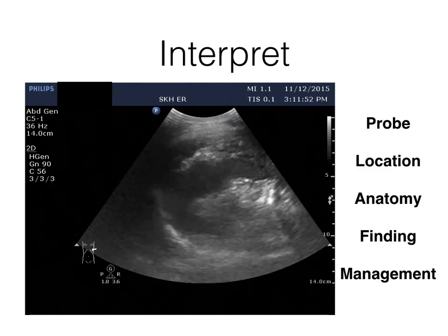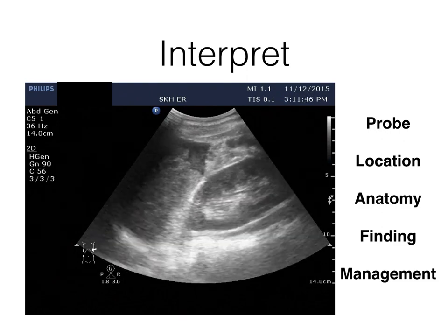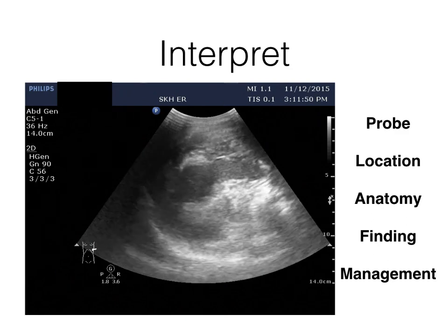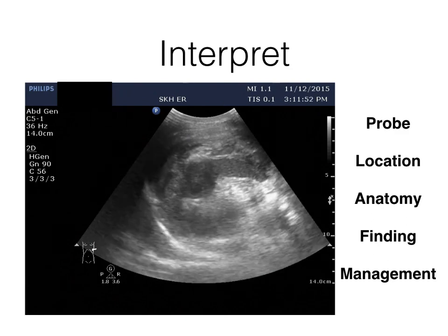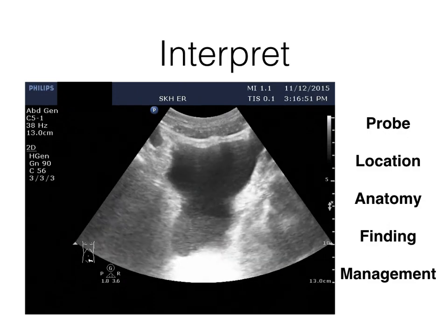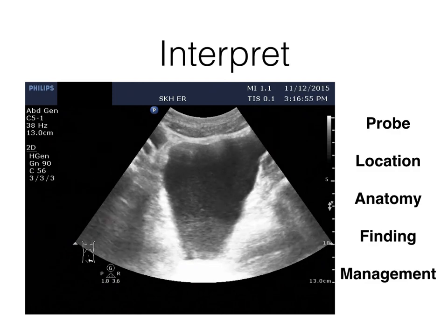And these are all clotted blood. This is the liver, spleen, right? The spleen. These are all blood clots. What do you see? The pelvic region, right? Transversely.